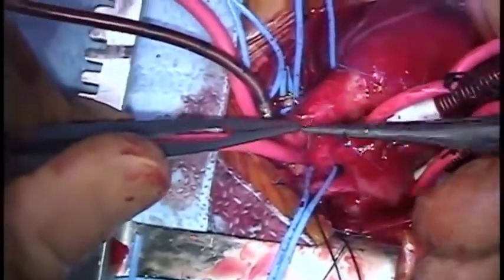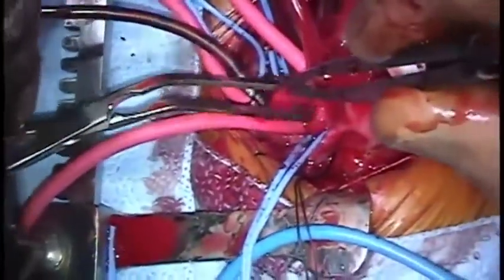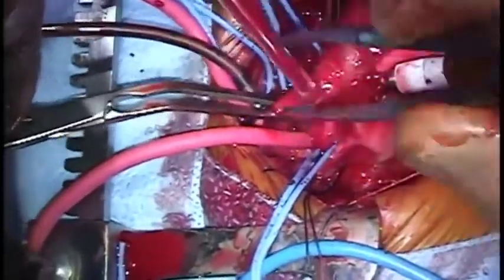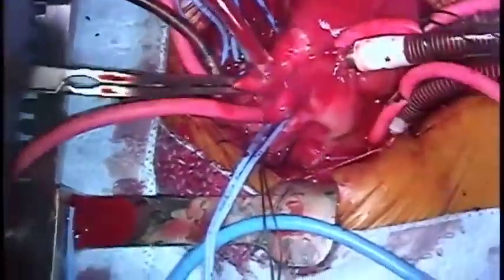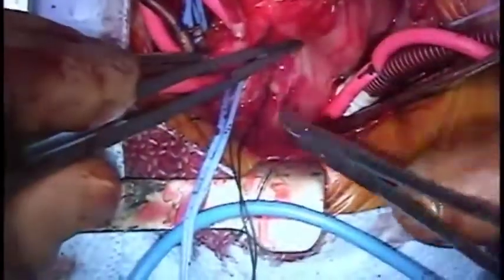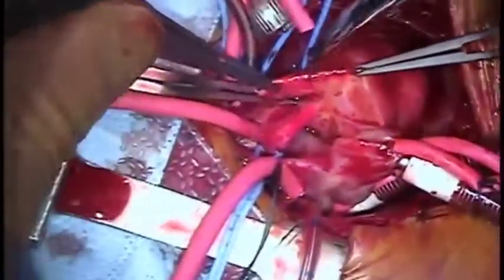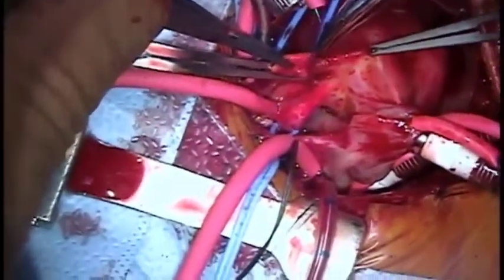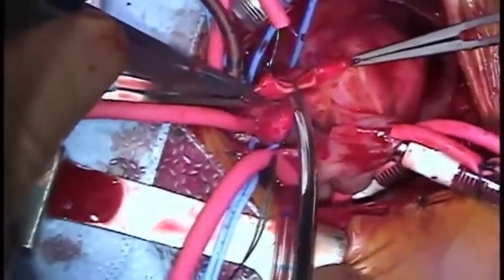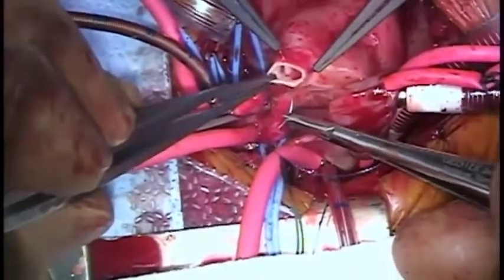As you can see, the heart is almost asystolic with the hypothermia, but is further protected with cold antegrade Del Nido cardioplegia. During infusion of cardioplegia, a vent is inserted into the left atrium by the right superior pulmonary vein. The aorta is divided at the cardioplegia site. This is positioned to provide an adequate length of neopulmonary artery and correctly position the aortic arch with respect to the neoaorta. This usually means cutting the aorta slightly more cephalad than the pulmonary artery.